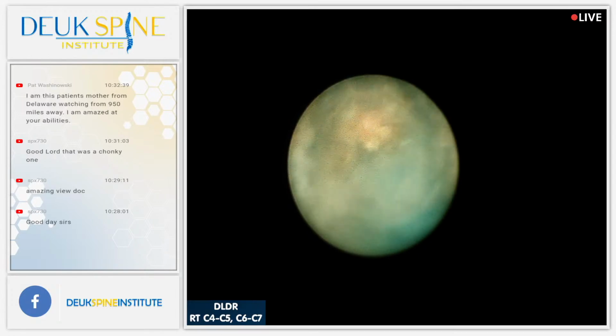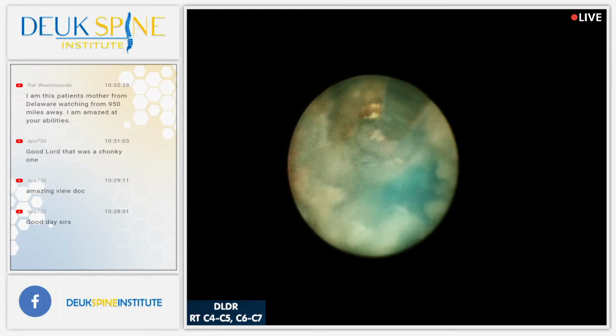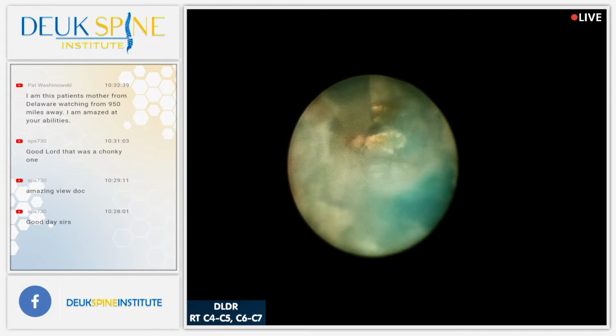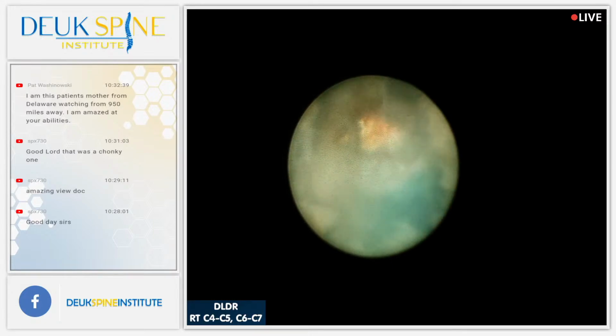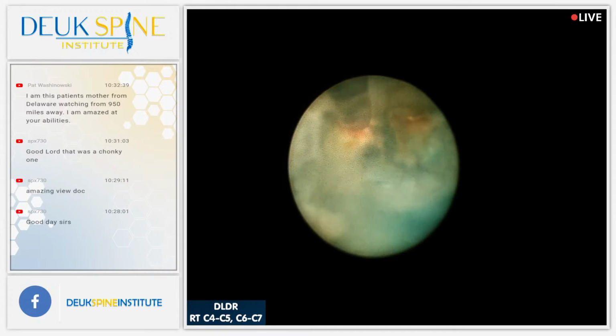We're getting out into the foramen. Here comes a piece. You see it? See it wiggling right there? Peeling it off the spinal cord. Peeling it off the spinal cord. This is the most delicate surgery you can do in spine surgery. And the laser, look at it. It's beautiful. It literally peels half of a millimeter. A millimeter is the smallest space you can see between your fingertips if you close them. This thing is peeling half of a millimeter.